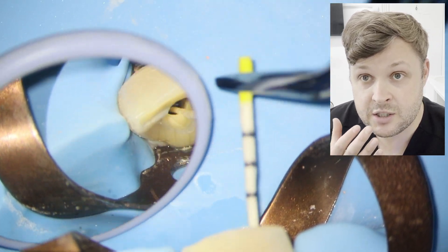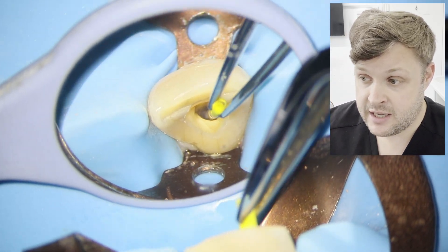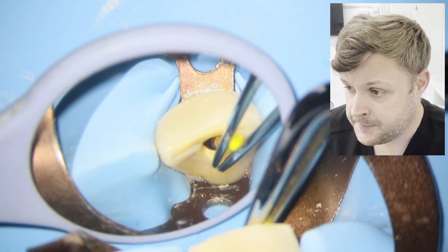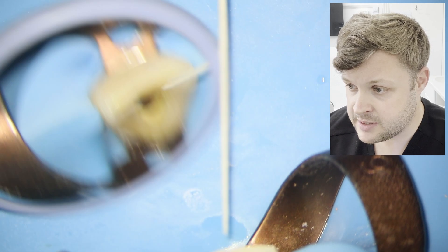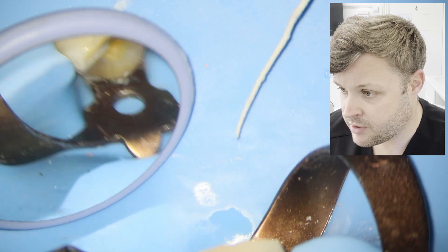Now I'm using paper points to dry the canal, because if the canal isn't dry that obviously affects the endodontic sealer you're going to use. I like to put the paper points in, inspect it, see if it's dry. It's not dry in this case, so I'll put another paper point in and have a look. I'm happy that it's now nice and dry.